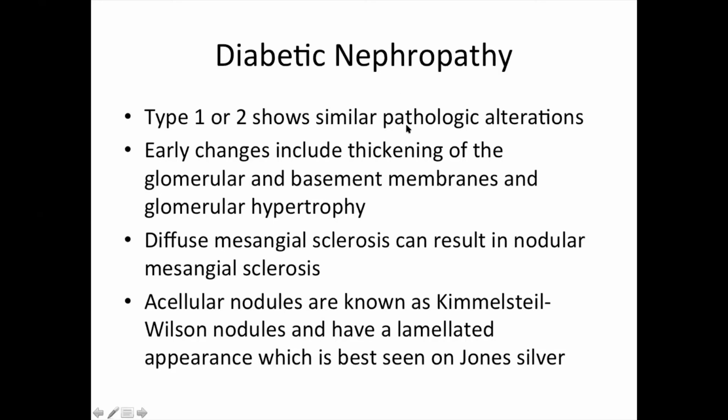what we will have with diabetes is glomerular basement membrane and tubular basement membrane accentuation on IgG. The reason we do albumin, and the center where I worked in was not doing albumin, is so they make sure they are not missing an anti-GBM.